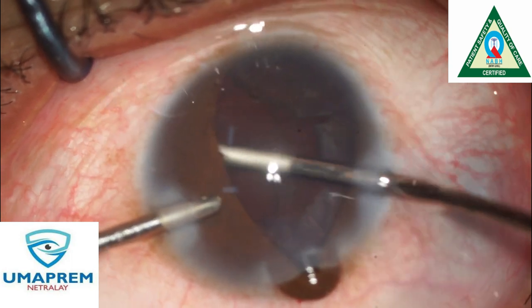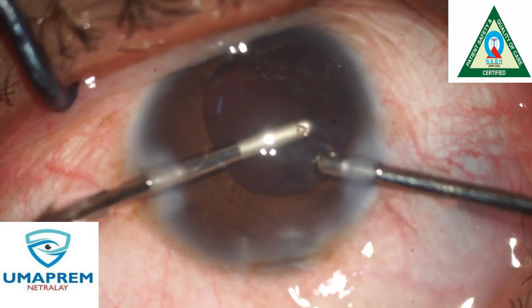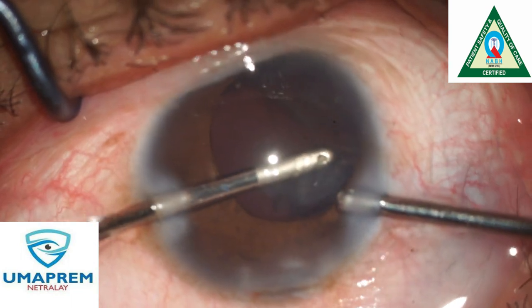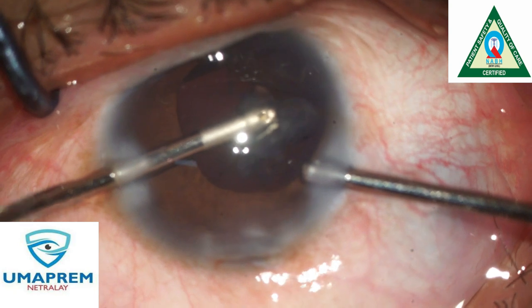After complete phacoemulsification, we do cortical cleanup. This is a very shallow anterior chamber and iris prolapse is present. We reposition the iris and perform cortical aspiration with a bimanual cannula.